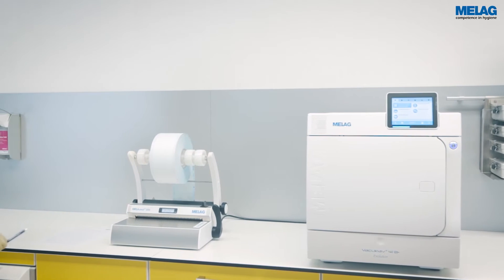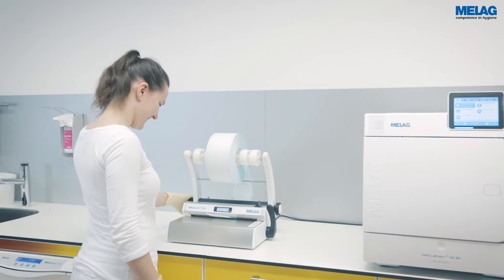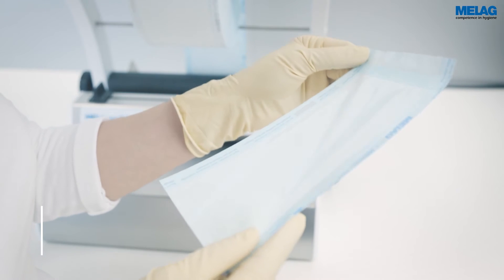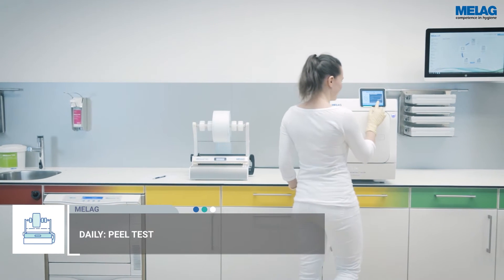Please perform a test seal every day before starting work. The seal seam must be even and complete. Additionally, the peel test provides a mechanical inspection.